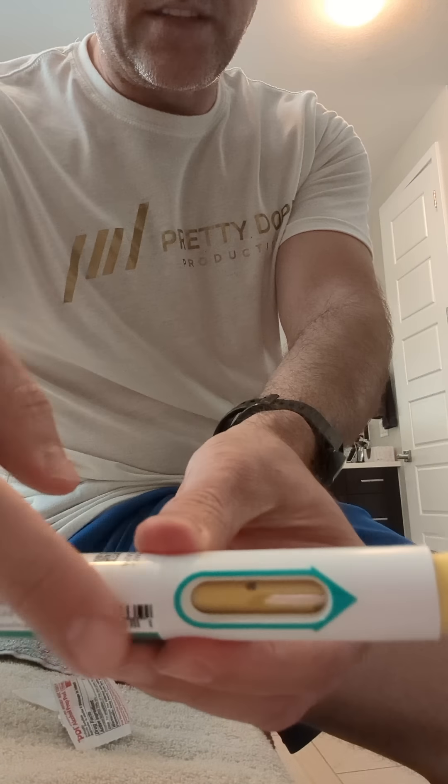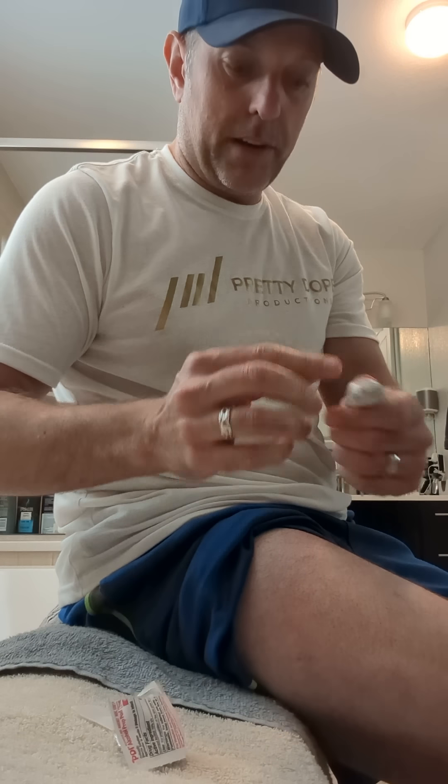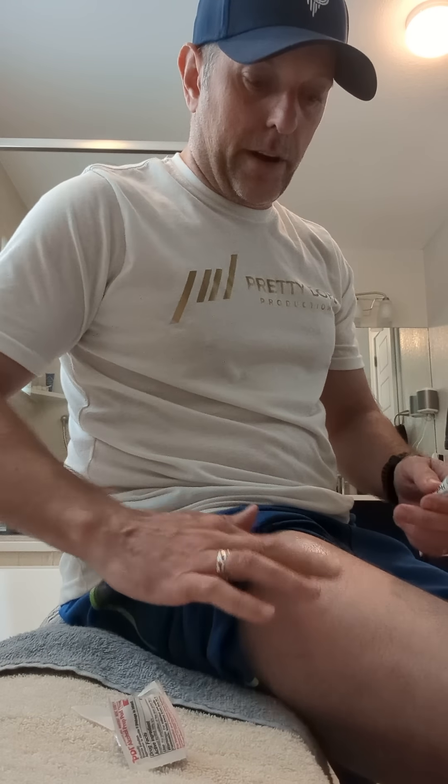So you can see this is yellow because this little plunger pushes down, and there's really not even much of a mark here on my thigh. I get a little bit of a bump and there's a tiny blood drop. But what I like to do is I have this hydrocortisone, like itch cream, and I put it on there right away.